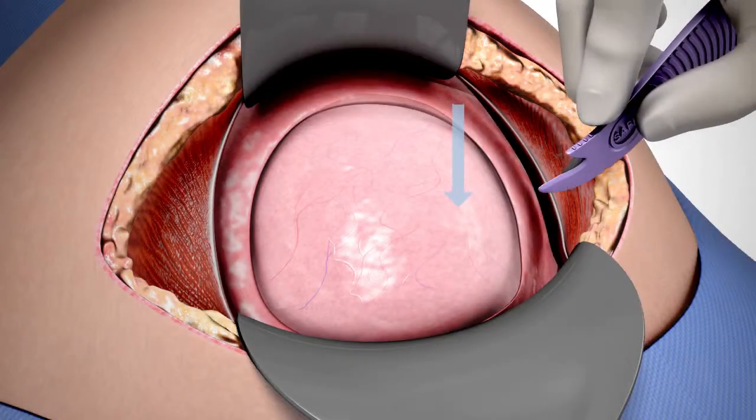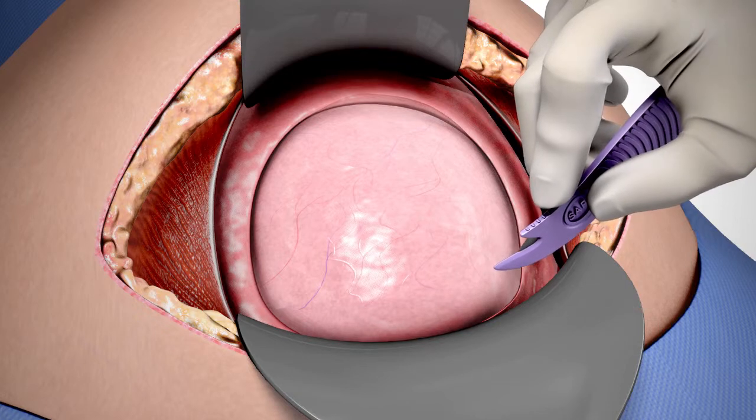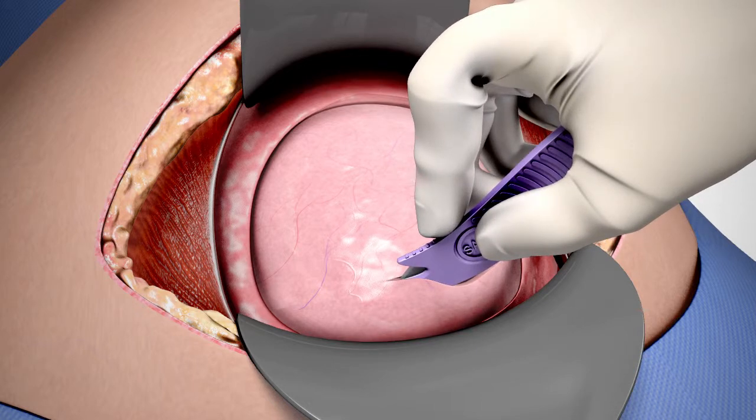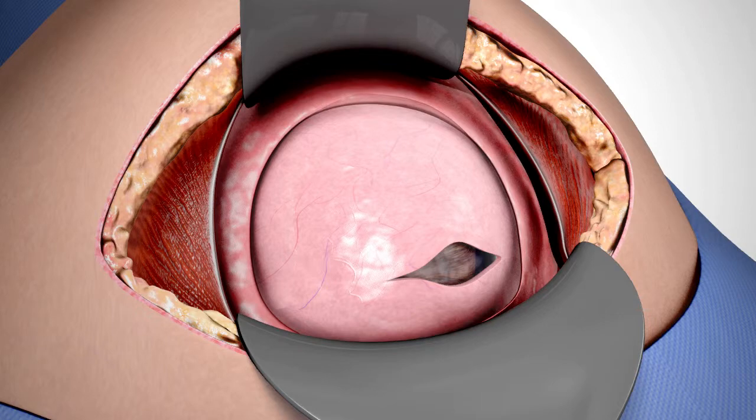By applying slight downward pressure to the base of the handle while running the tip along the striations of the tissue, the tip will catch either in a striation or a forming ripple in the uterine wall. The surgeon should try to tent the anterior uterine wall upwards while swiping across the lower segment. Once the tip has penetrated the tissue, the incision is continued transversely, ensuring that the tip and blade are moving up and away from the baby.